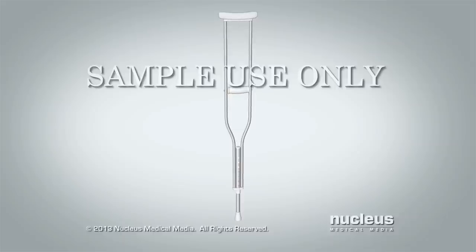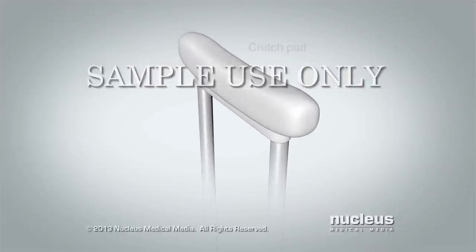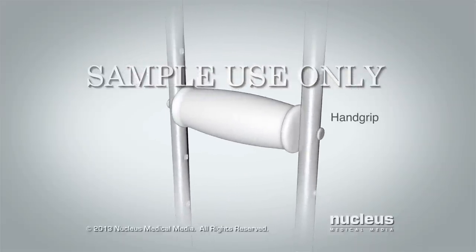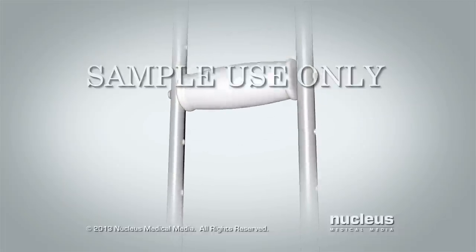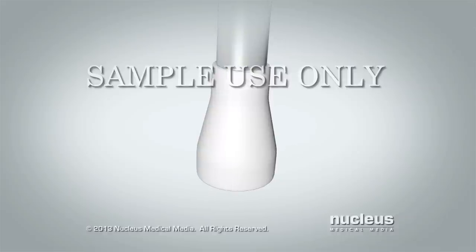We'll be talking about certain parts of crutches in this video. The top part of the crutch is called a crutch pad. The handle in the middle is called a hand grip. The rubber bottom that touches the floor is called the crutch tip.